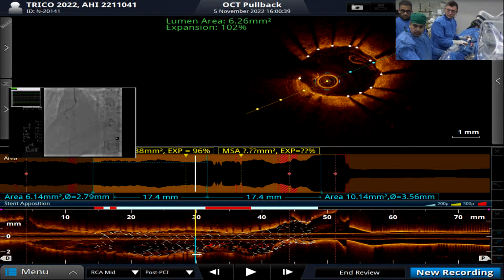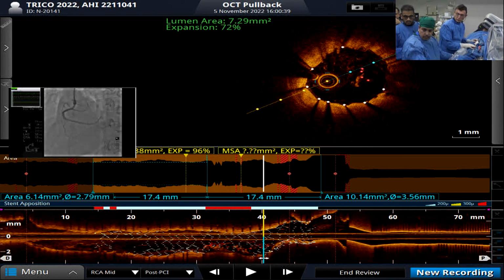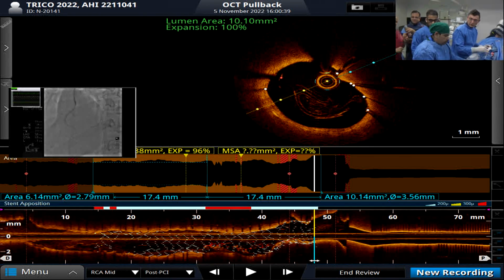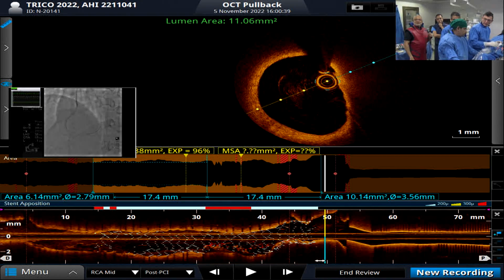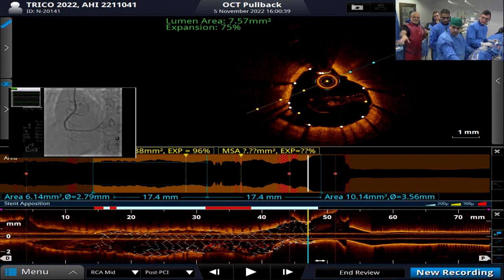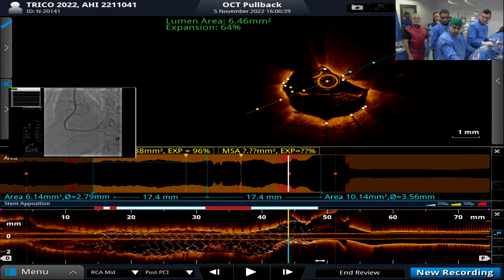So do you think that there's a little bit of a point of constriction there? I think it's just a swirling dye. Yeah. Okay, go forward a little bit. Go forward. Inside the vessel. Perfect, perfect. Keep going forward. Forward, forward, forward. This is, okay, that's a side branch.